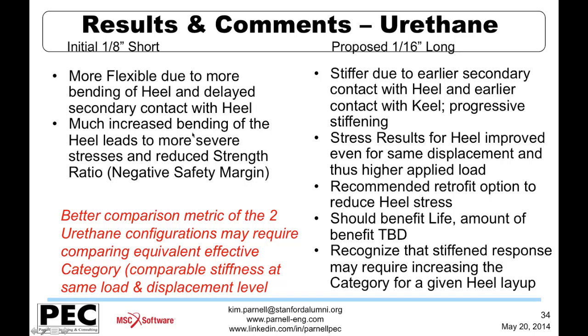But the observations are pretty clear that there's additional flexibility in the shorter component, a lot more bending there that leads to more severe stresses and reduced levels of the strength ratio. And this is really just looking at stress aspects only, not yet delamination or interlaminar types of components. So we'll talk a little bit more about that in a moment. This other urethane pad provides more secondary contact or earlier contact. You get a lot more progressive stiffening out of it, and it looks like it has some definite benefits in terms of providing additional stiffness, but with less overall bending response.